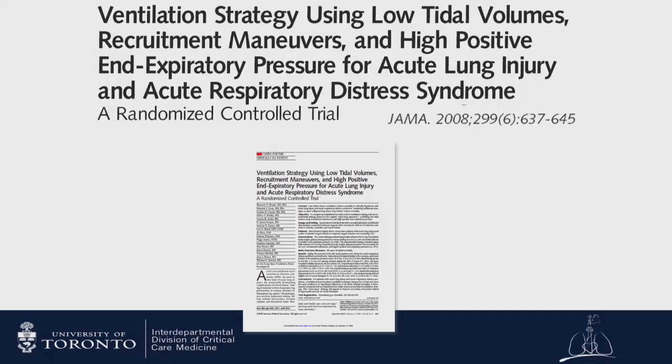And that means that essentially you're delivering a double breath, because rather than one volume being nicely globally distributed, it's all going to one part and then all coming out to another. And that may be another mechanism by which spontaneous breathing is leading to lung injury in severe cases.